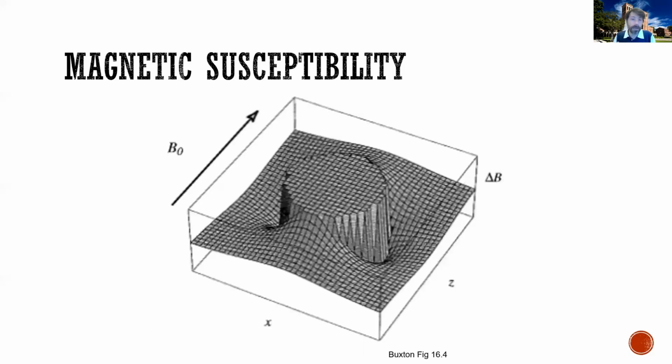So finally, to show it in a different way, this is the exact same model that I showed earlier. This sort of carpet that you're seeing represents the strength of the magnetic field in any pixel of this image. For example, you might imagine that we have two protons right here, and they are in a certain magnetic field, but because in here there is deoxyhemoglobin, see, it creates this big warping in the field. The field is not homogeneous at all. And so these two protons might be resonating at a certain Larmor frequency, whereas these two protons will be resonating at a very different Larmor frequency.